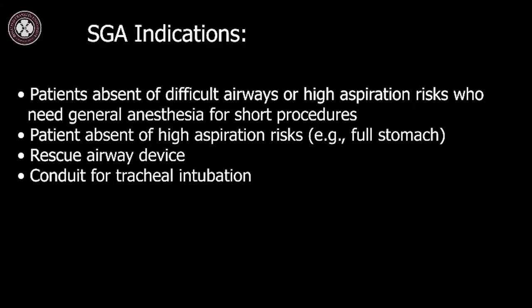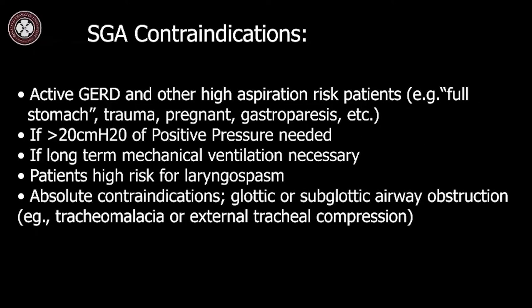Patients who are candidates for SGA use are those who are absent of difficult airway or aspiration risks and will require general anesthesia for short procedures. SGAs can also be used as a rescue airway device and as a conduit for tracheal intubation. This video will demonstrate insertion of a supraglottic device under non-emergent conditions.